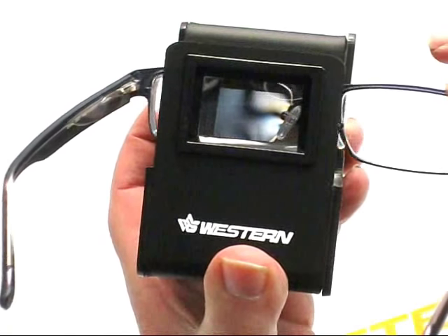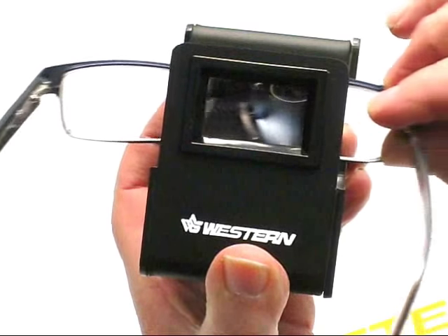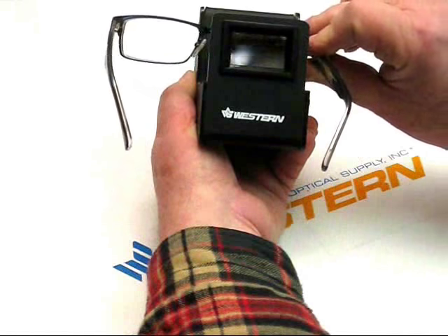You want to do this because you don't want to insert lenses into frames and have the stress so high that the lens will shatter or pop when going from a warm environment to a cold environment.